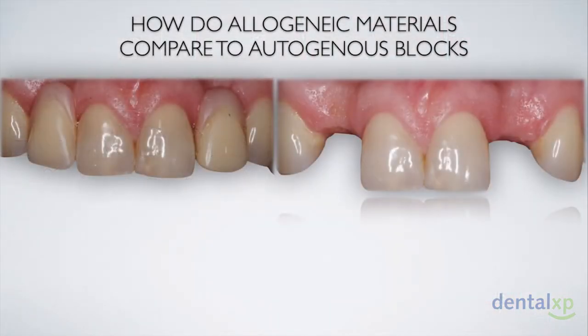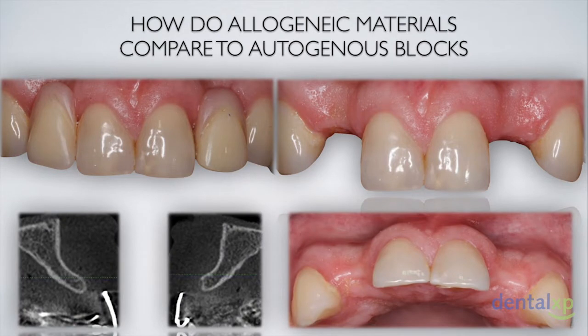So fortunately we had the opportunity to have this patient referred to us for replacement of 2 missing lateral incisors that were lost due to a previous endodontic infection. She presented with buccal deficiencies in the sites of the lateral incisors, and if we take a look at the CT scans, you could see 2 very similar defects in both morphology and severity.